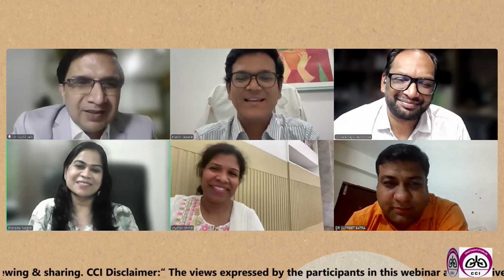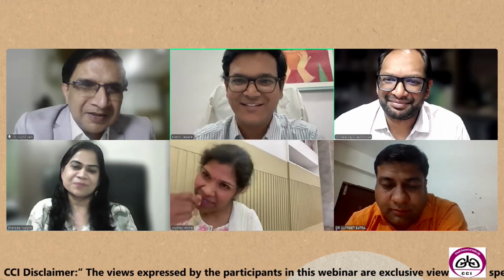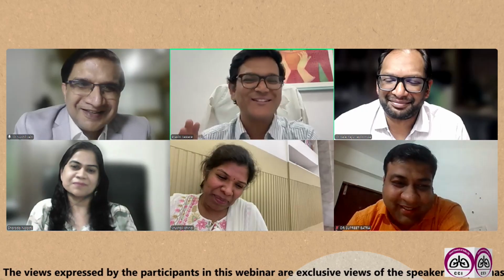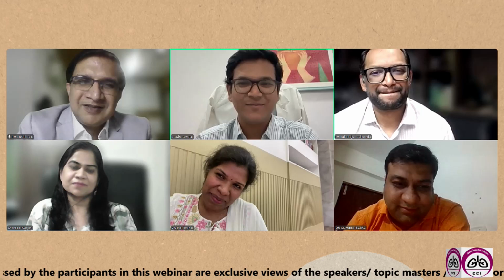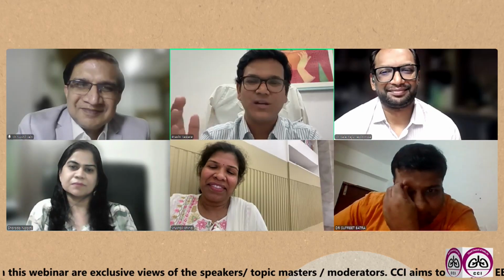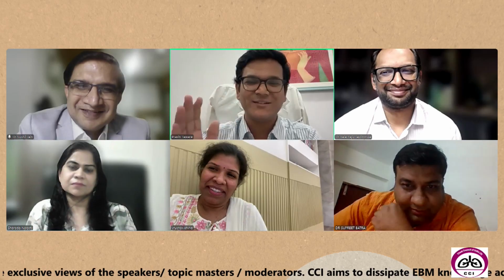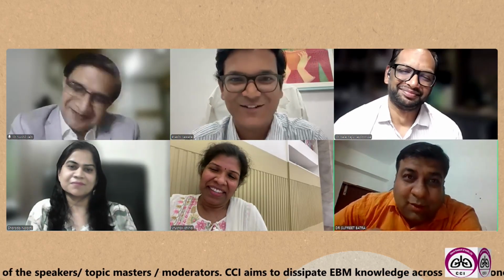And Dr. Pravin, you want to add something? Yeah, I just wanted to say in early days I was struggling with anesthesiologists, because you need to make sure you are good friends with anesthesiologists because they are in a hurry with other procedures. They are always in a hurry. They are like, how many more passes, how many more passes? And I used to tell them we are at high stakes. We need minimum 4 passes each node. So make sure you are a good friend of anesthesiologists. And one more thing is always get cardiac clearance.